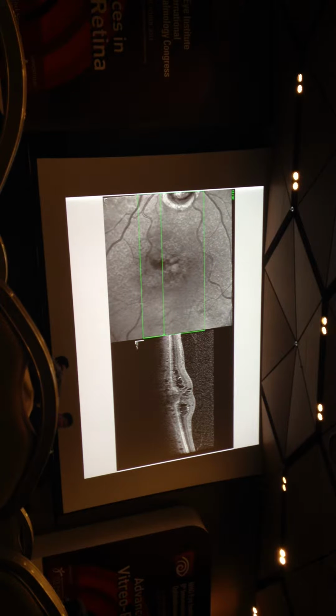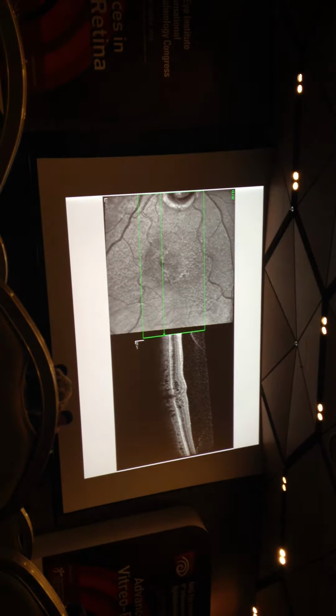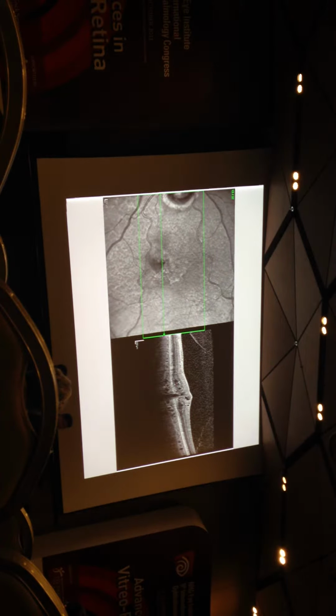Since we know that the RAP lesion is very aggressive, with both eyes involved in less than one year, and the PRONTO study, by the way, underlined that the lesion that needs more injections was the RAP lesion, should we continue to treat, or just treat when the fluid is coming back and the lesion reactivates? Probably, I don't know. Going back to the case, there were many times of reactivation and closure of this vessel.